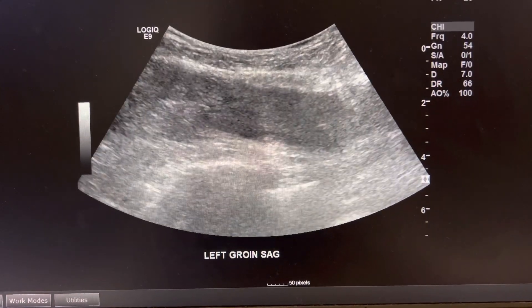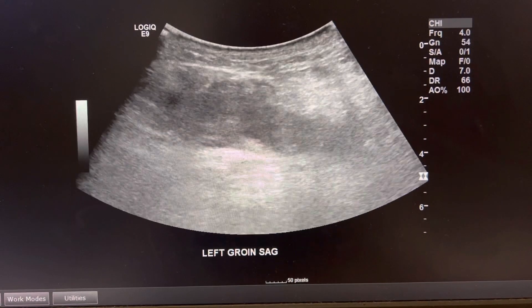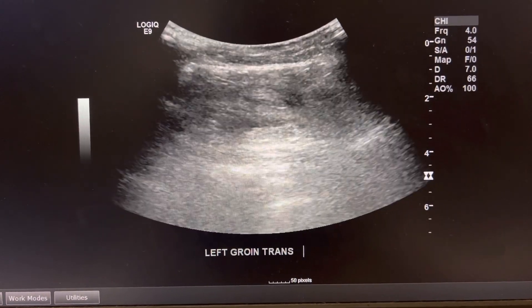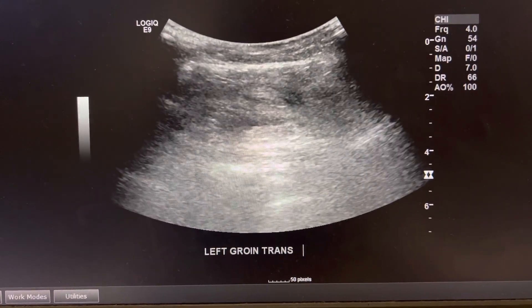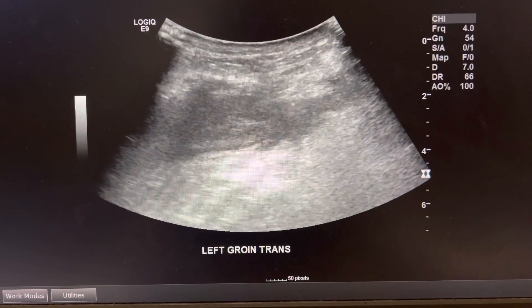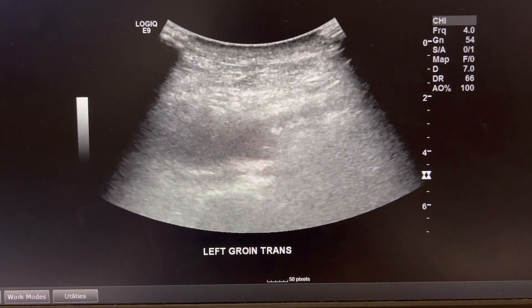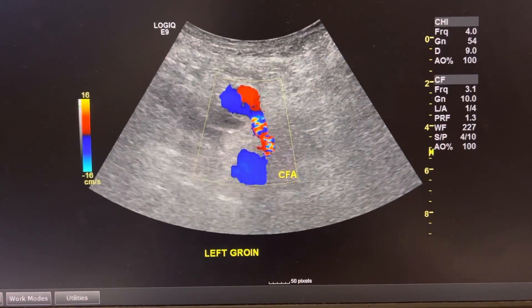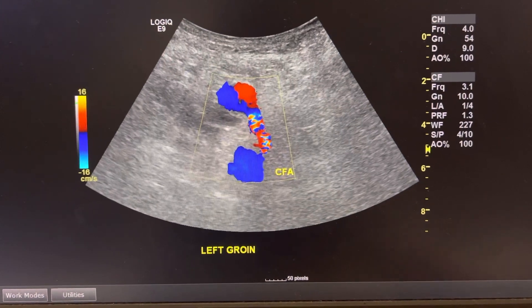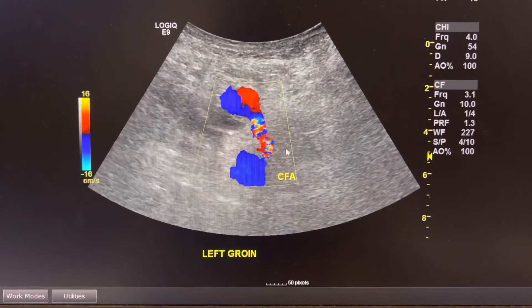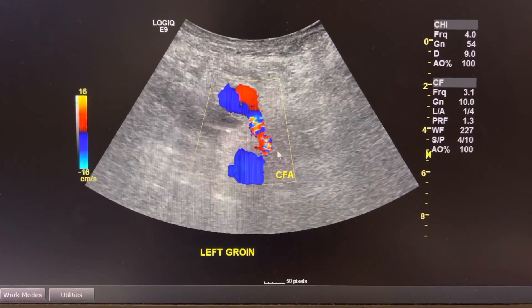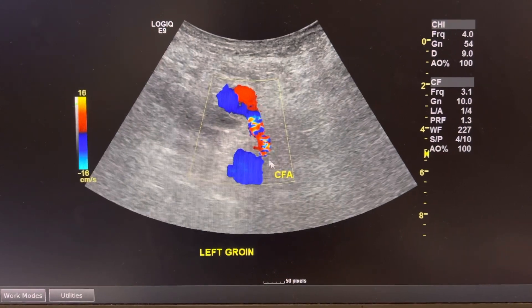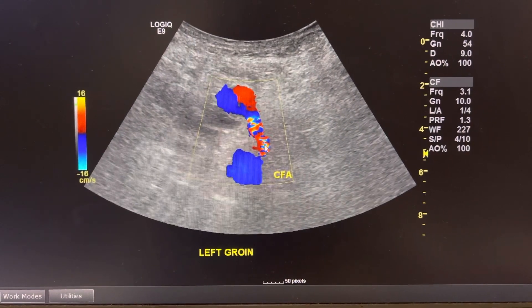In order to see the pseudoaneurysm, I had to find where the common femoral artery was so I could see if there was anything connecting to it. After I took all my pictures of the hematoma, I finally found the common femoral artery, which is right over here, and this is the common femoral vein.